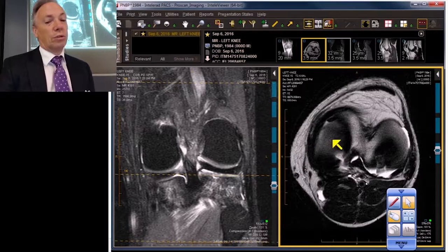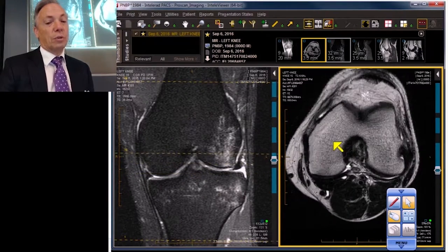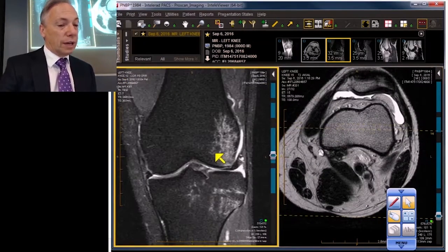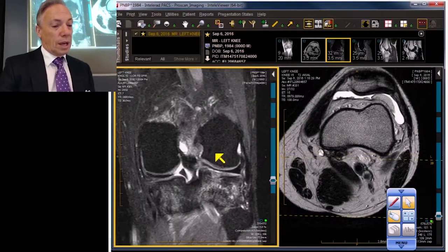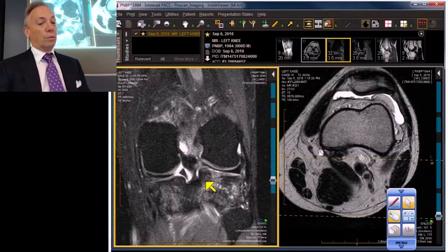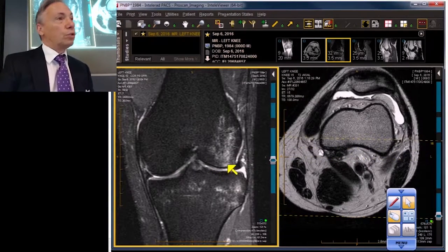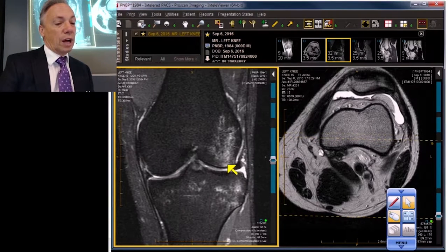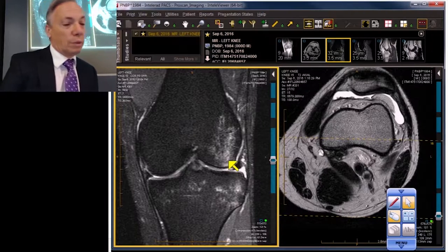Now it's time to look at the meniscus in another projection, even though there's lots more information about what's happening with the ligaments in the axial projection — but that's a story for another day. So now let's look at the coronal. We have extensive bone marrow edema, which tells us posteriorly in the tibia that we've had a pivot shift. We also have the typical terminal sulcus injury, again supporting the mechanism of injury of a pivot shift, which we will go over when we focus on ligaments.